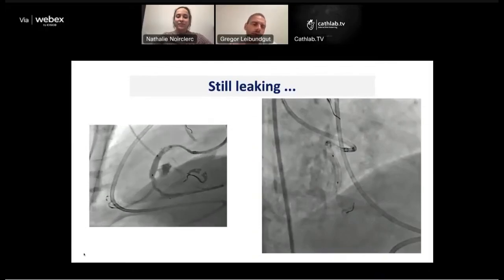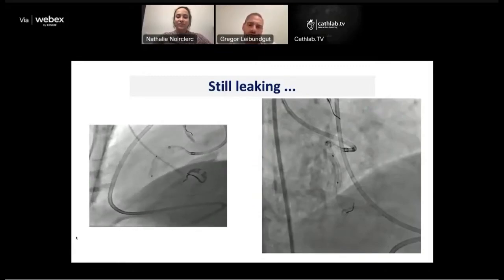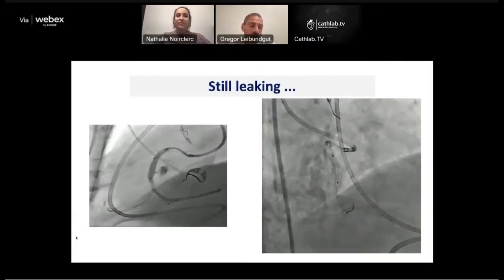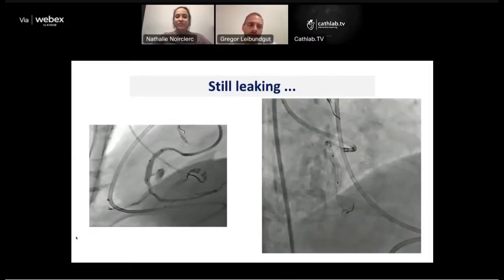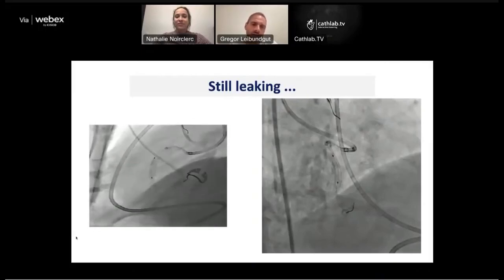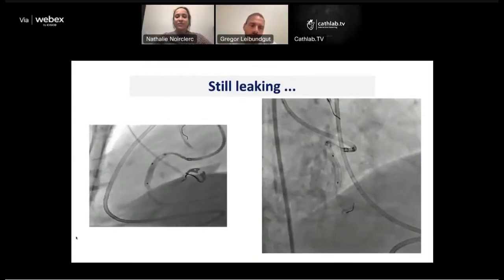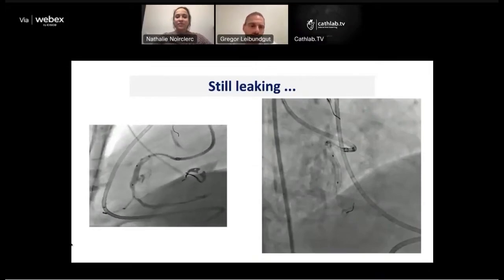Second of all, this one, I'm absolutely sure that you covered the perforation, but it's called endoleak. The stent usually is not flush on the wall because it's calcified. It's like a lunar surface almost, if you think about it in macroscopic views. And the graft, the PTFE layer, is not able to completely seal that rugged terrain, so it can bleed behind and then exit the perforation hole. So it's called the endoleak, and you will probably show solutions how to solve this issue.